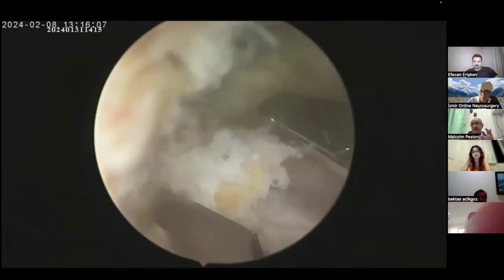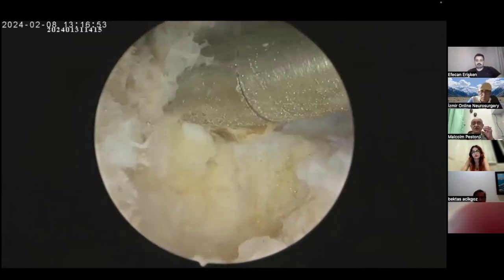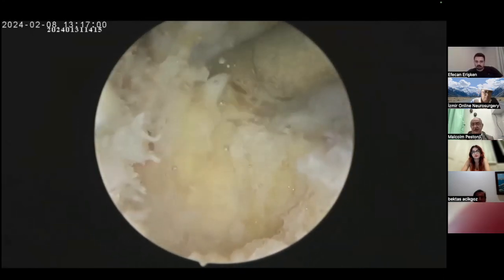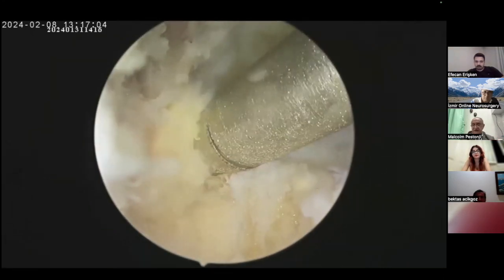So the veins are a persistent anatomical landmark, which you need to understand. They exist there, they're there to guide you. Use them to your advantage. You will be a happier surgeon at the end of this surgery.